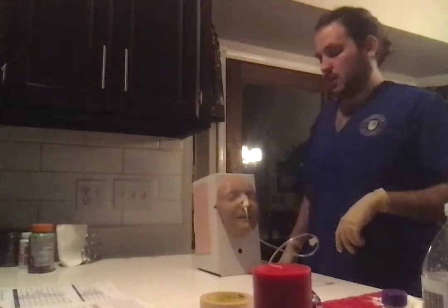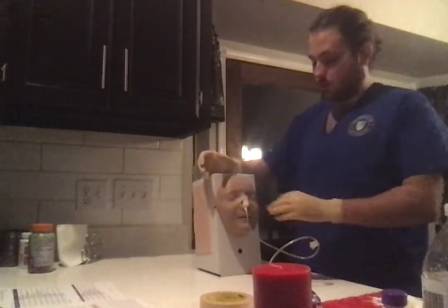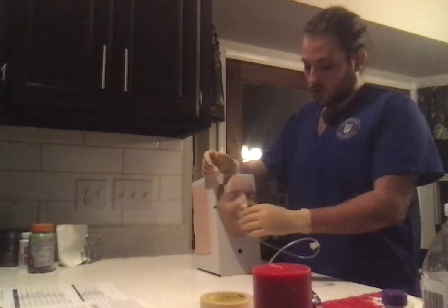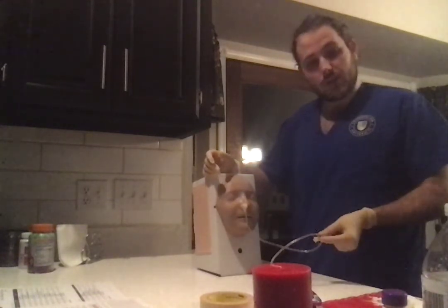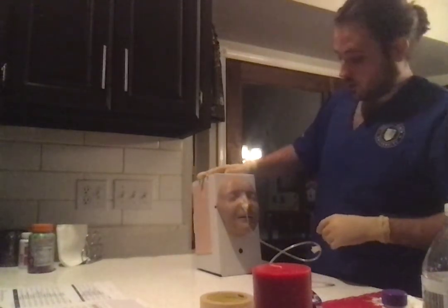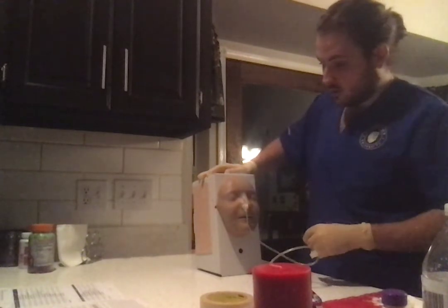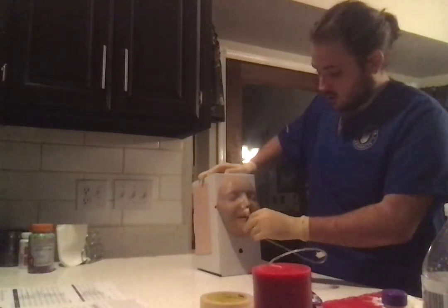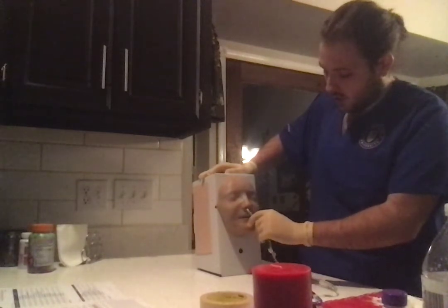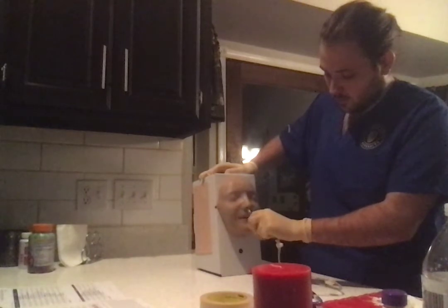For removing the tube, you want to start from the head down. So first you would remove the tape off of Mr. Laerdal's nose, unclamp it from his gown. Alright, instruct Mr. Laerdal, you're going to hold your breath as we pull this out. You just kind of, not quickly, not rip it, but kind of quickly inch this out.